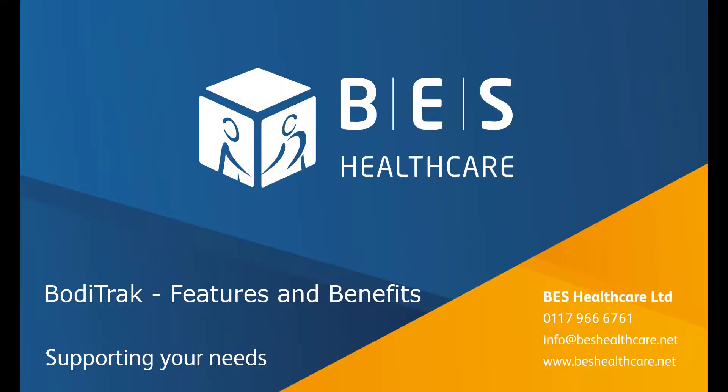Welcome to the BodiTrak features and benefits video, where we'll run through what the BodiTrak Pro pressure mapping system has to offer.